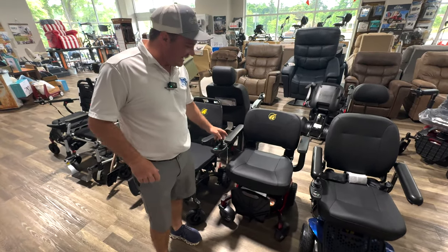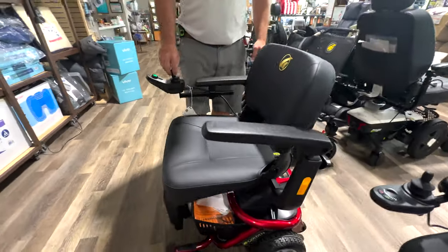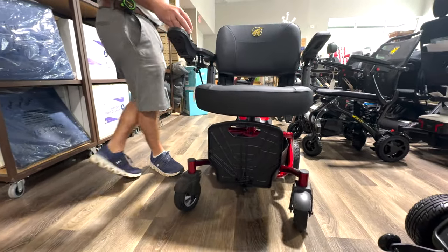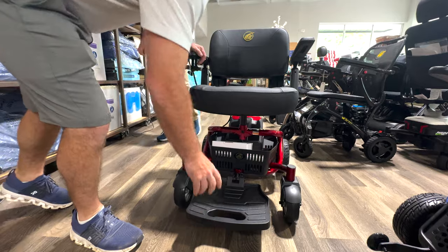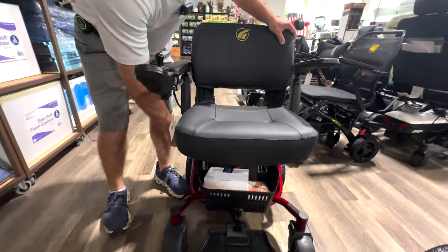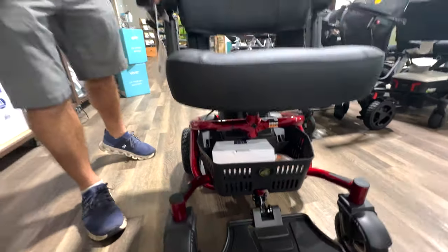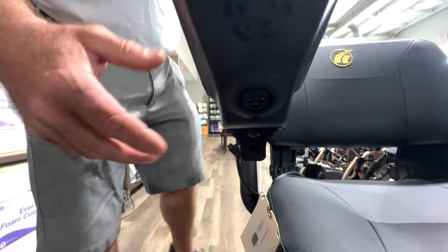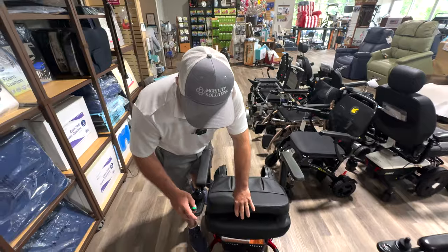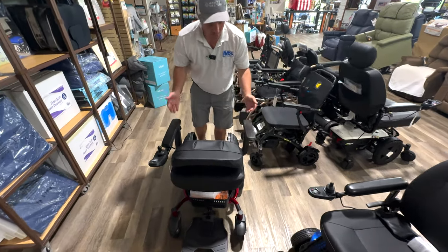This is the Golden Envy. Golden makes this chair and they make what they call the LT — a little bit smaller version of this. This is the Golden Envy power wheelchair that can be disassembled. 300 pound weight capacity. Swivel seat. It has a basket underneath it. You can charge it through here. Programmable controller. You can also charge it through the battery.